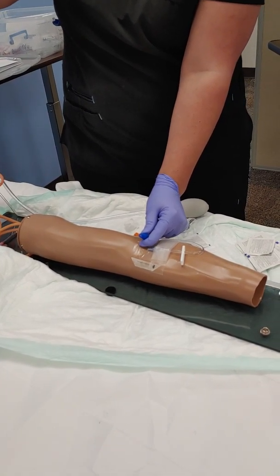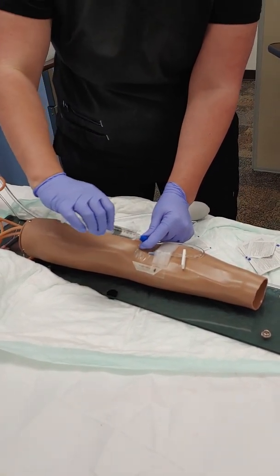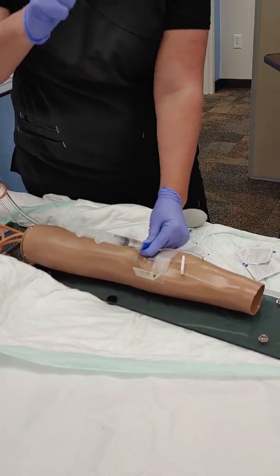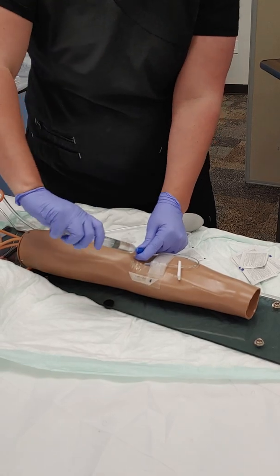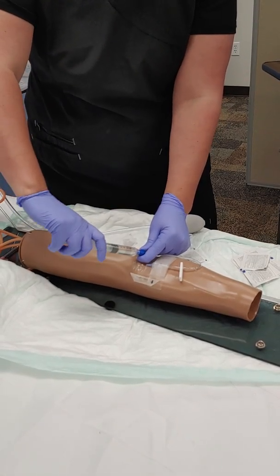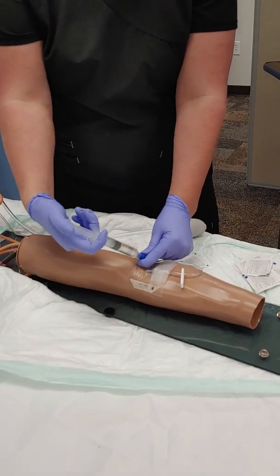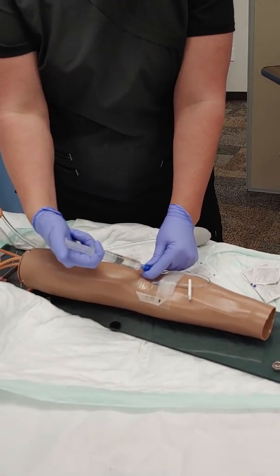Making sure you got rid of your bolus. Gently pull it back on the syringe to check for blood return. Okay, making sure I got rid of my air bubble in there. I unclamp this. We gently pull back. You'll get a blood return. Now you might not have the plastic arms. Okay, and then I'm going to slowly flush it in.